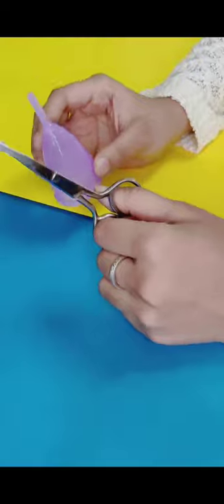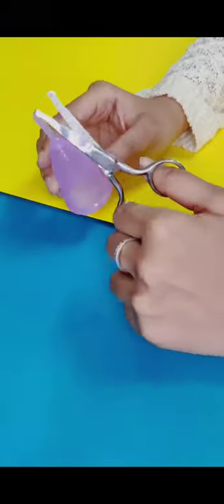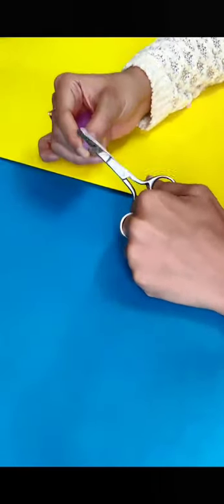On the menstrual cup you can see three markings: one, two, and three. Always start with the first marking, and make sure you do not overcut, because you cannot put back the stem.